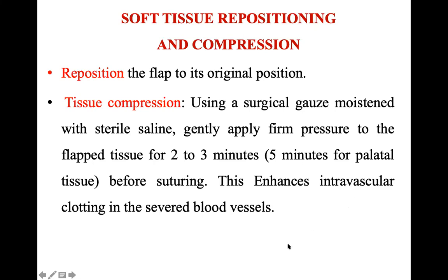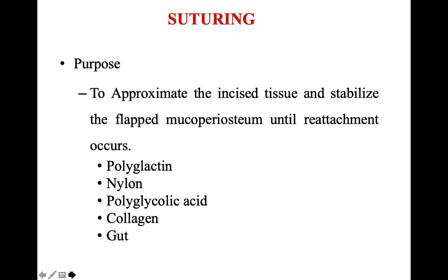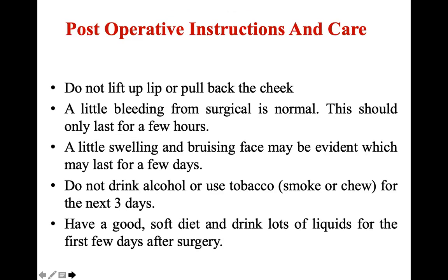Okay, then soft tissue. Once you have removed the apex, filled the cavity, now you have to go back and seal the cavity with the soft tissue. So you have to reposition the flap. Once you replace the flap, then gently compress the flap so that this will enhance the clotting in the severed blood vessel. And as you know, clotting is essential for repair to occur. Then you suture, you know all the suturing techniques, you know all the suture materials. I'll not go into detail of this.